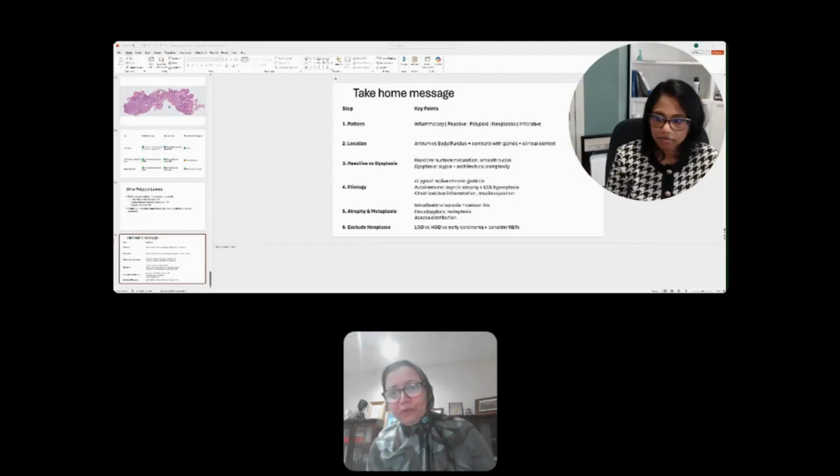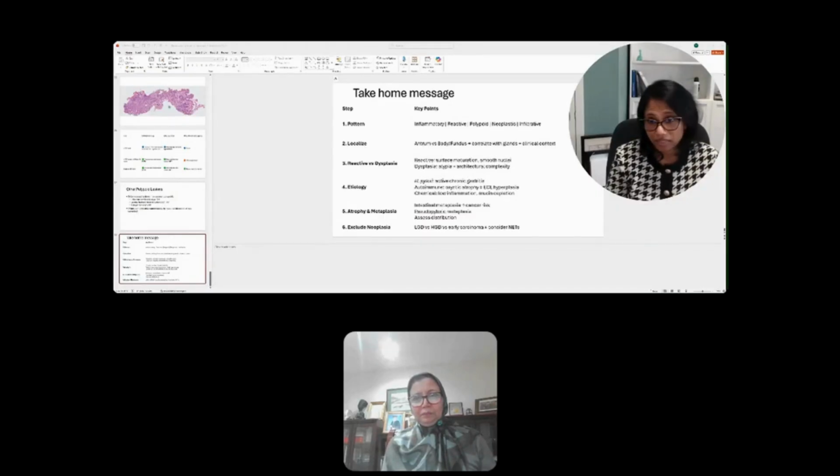Another question from the audience. Do you grade dysplasia in pyloric adenoma? Yes, I do. In this case, this was negative for dysplasia, but if there's low-grade dysplasia, absolutely, and if there's high-grade dysplasia, absolutely. And you may even have invasive cancer arising from it, although I haven't seen it in practice. So yes, absolutely, I do.